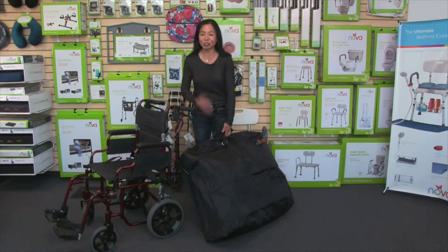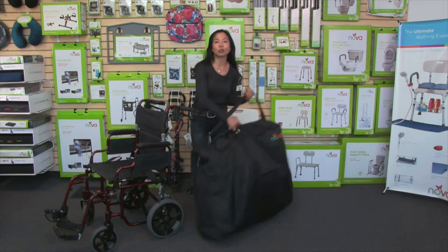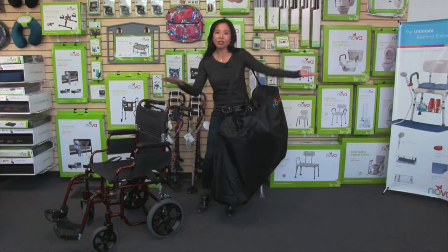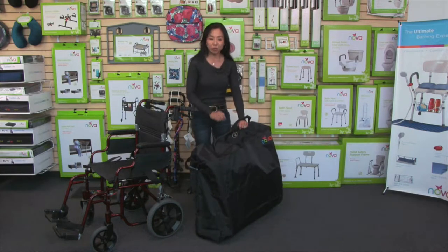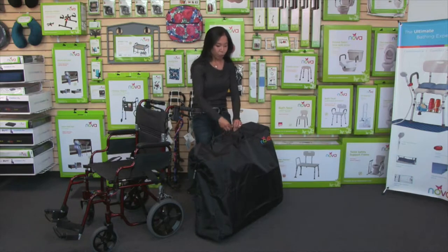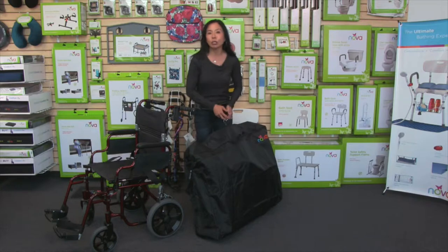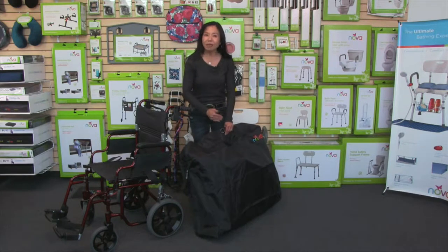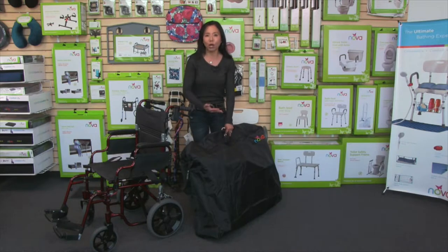This bag is so easy to use. We've got hand straps and also a convenient shoulder strap. I've got a Zoom walker in this bag right now, and it's so easy to carry. The shoulder strap is also removable, and we've included key rings with the zipper, which makes opening and closing the bag so much easier. This bag is lightweight, very durable, easy to clean, and also water-resistant.